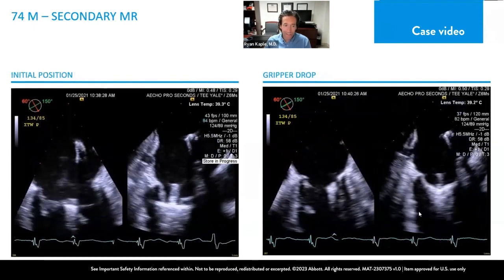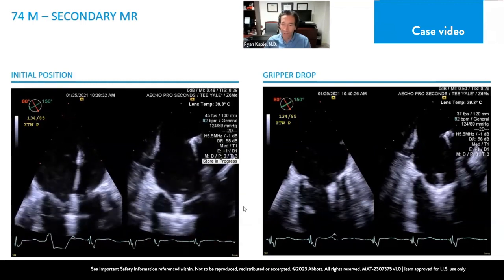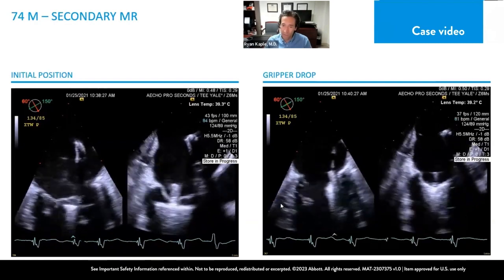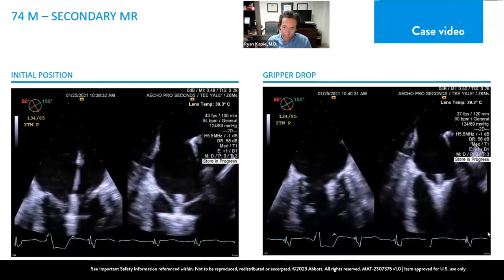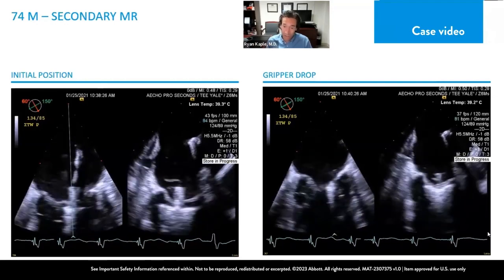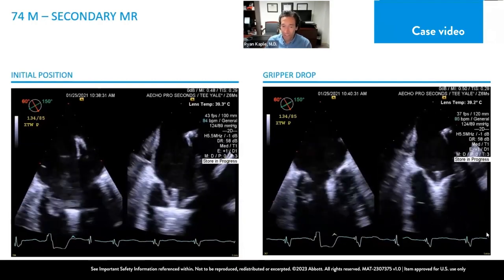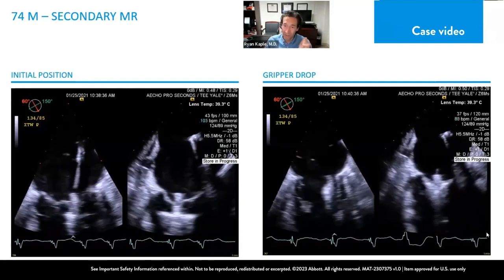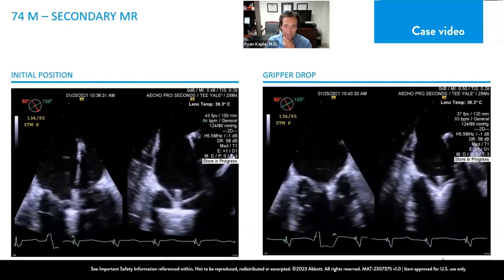And so this is an interesting case because sometimes when you have a lot of guide in place, when you're going after a lateral defect, it can cause a fair bit of shadowing. And so you can see on the image on the right, we lost some view of our anterior leaflet. It's because of the shadowing of the guide. It can be really challenging to overcome that because you really want to image in that location that has the shadow. So I don't know if there's any tricks to get around that other than changing your angle of approach, which is a big undertaking, but can be done.